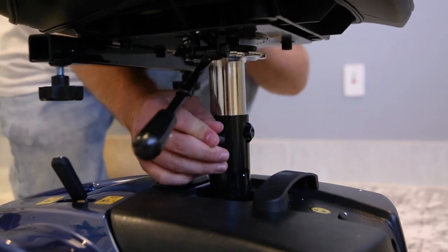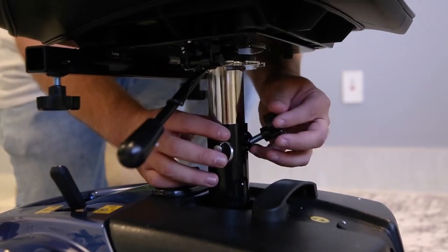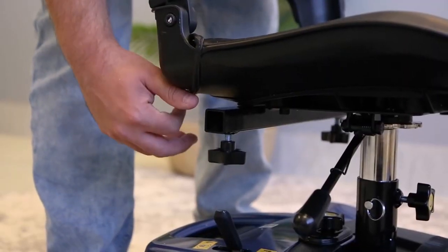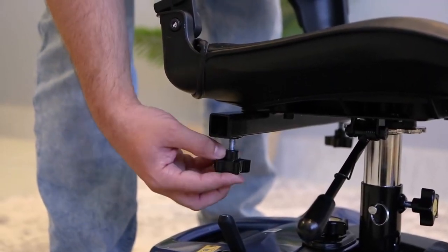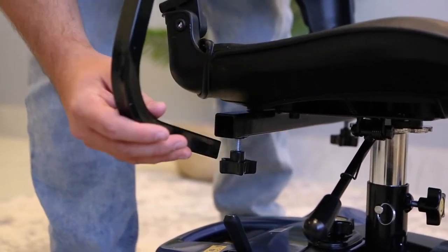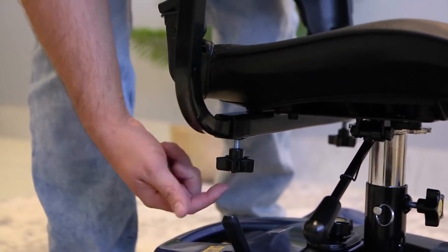Lift the seat to the desired height and fit the pin in the respective hole. Then screw the star knob until tight to help lock in the seat. Moving now to the armrests — take a look at the side of the seat. See that star knob? Loosen it to make room for the armrest. Now insert the armrest and tighten the star knob. Repeat this step for the other side.